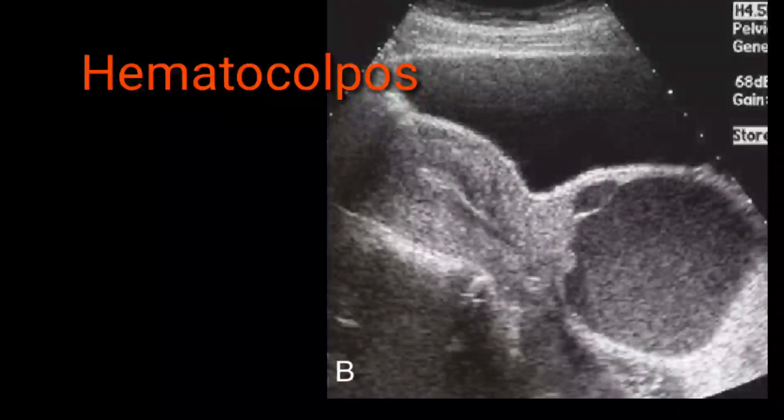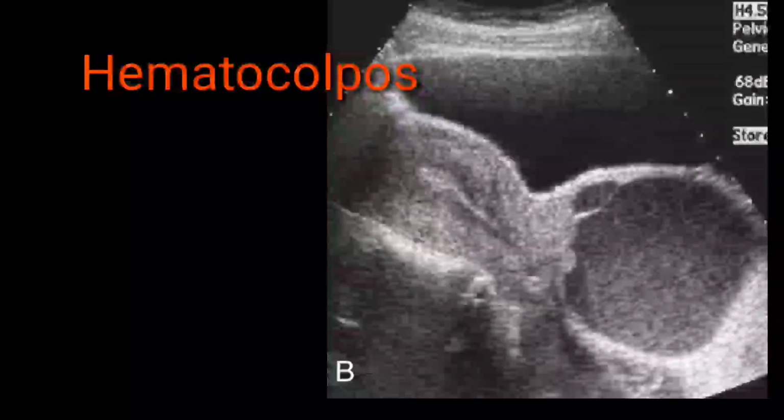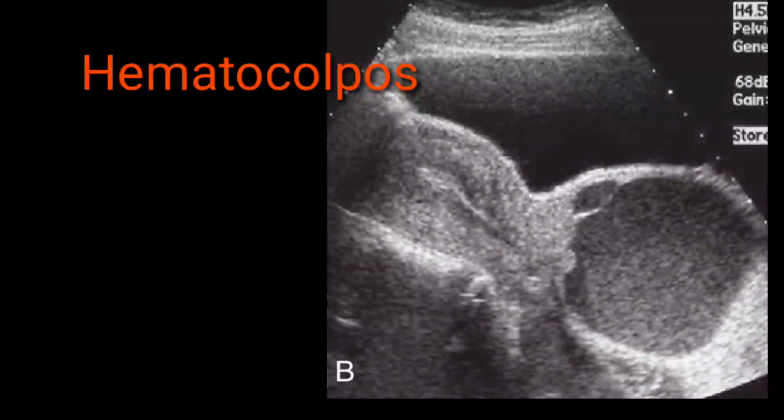This is the same patient, but only a transabdominal scan has been done. Here you can see a distended bladder, and the uterus is clearly visible, because on the transabdominal images a broadened view can be seen. So under the transabdominal scan the uterus is clearly visible, the endometrial cavity is clearly visible, but down to the cervical region, which is the area of the vaginal canal.